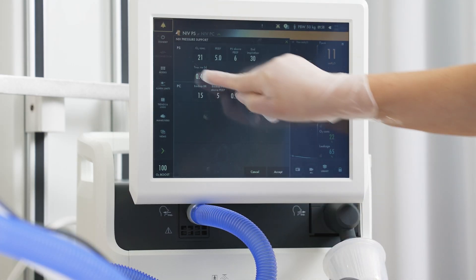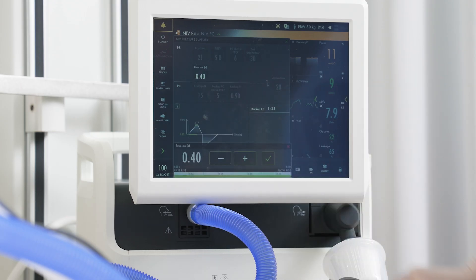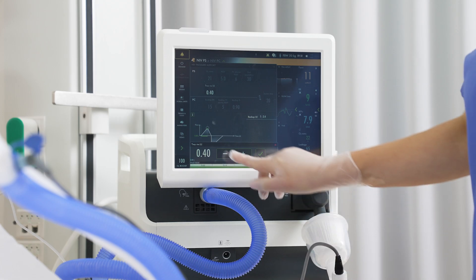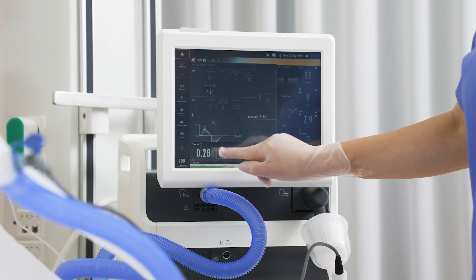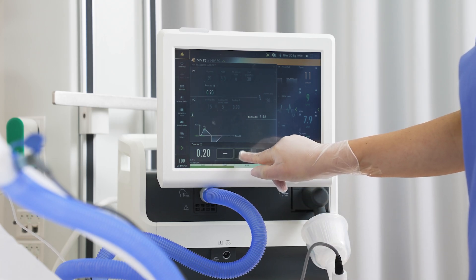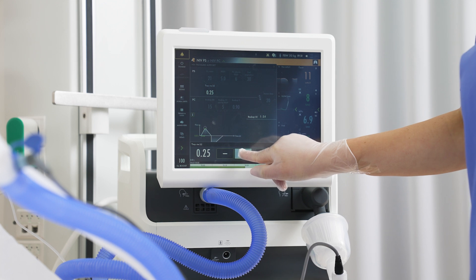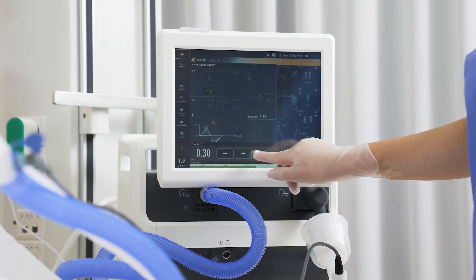Tap on the ventilation mode to open the settings window. Some of the settings have contextual help and illustrations to show how the breath will change when the setting is altered. The inspiratory rise time setting determines the amount of time it will take to reach the set pressure. Adjusting this value will allow for better synchrony and patient comfort.